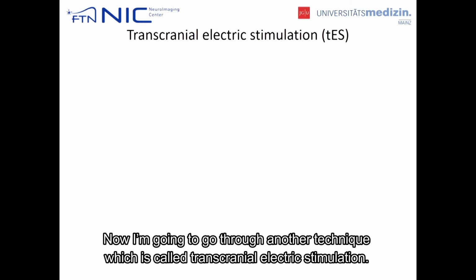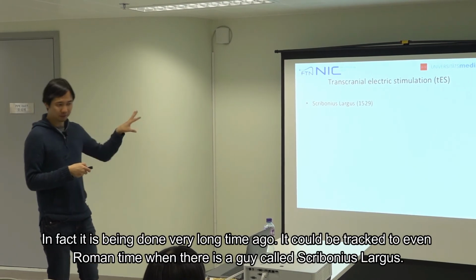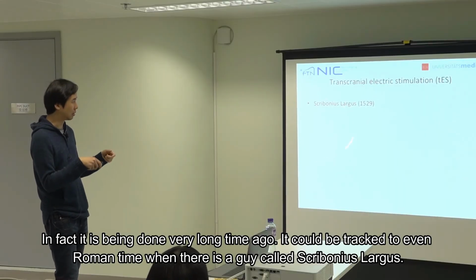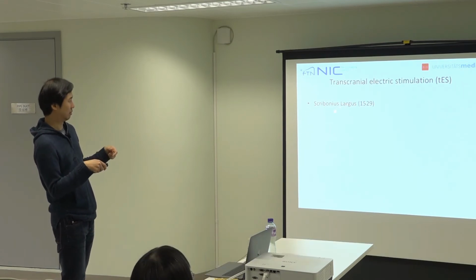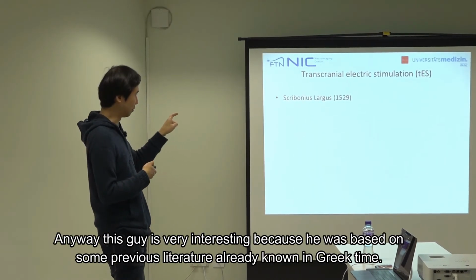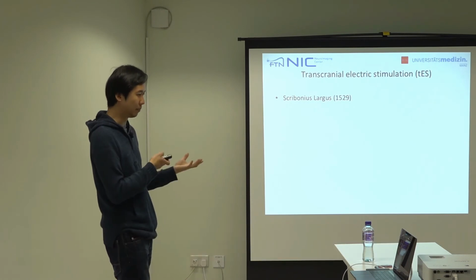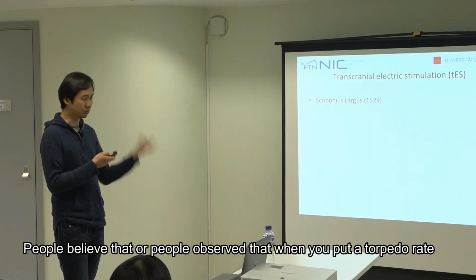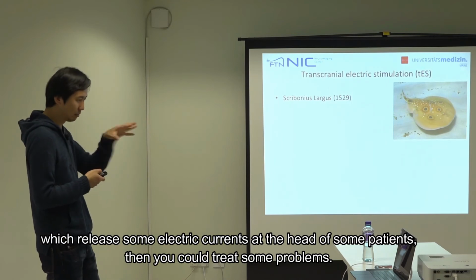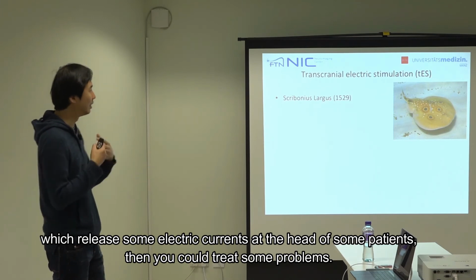Okay, so now I'm going to go through another technique which is called transcranial electric stimulation. In fact, it was done a very, very long time ago. It could be traced even to Roman times, when there was a guy called Scribonius Largus. I think it should be pronounced in Latin, so I'm not very good. Anyway, this guy is very interesting because, based on some previous literature already known in Greek times, people observed that when you put a torpedo ray, which releases some electric current, at the head of some patients, then you could treat some problems.